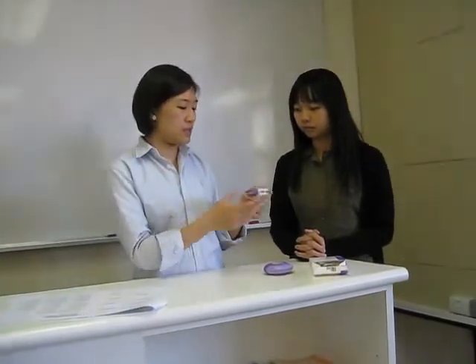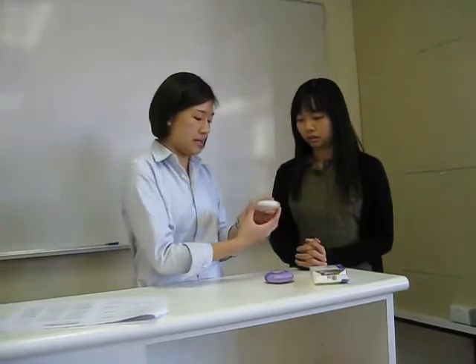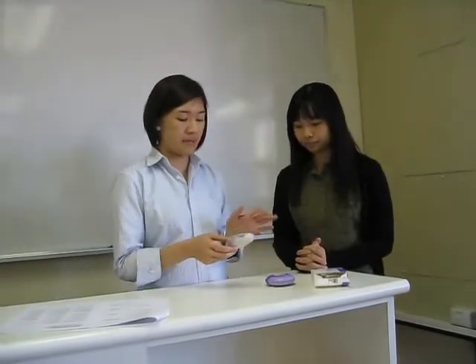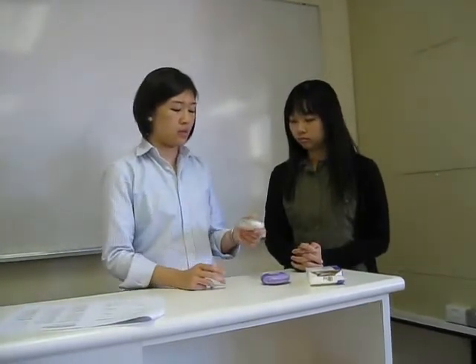After using it, it's very simple — you just close it back. You don't need to touch the lever system anymore. Just put your thumb here again and push it back until you hear the click sound, and the lever system will go back to its original place by itself. And that's it. For this medication, you use it regularly once or twice a day — you inhale it once or twice a day, like in the morning or at night, about 12 hours apart.